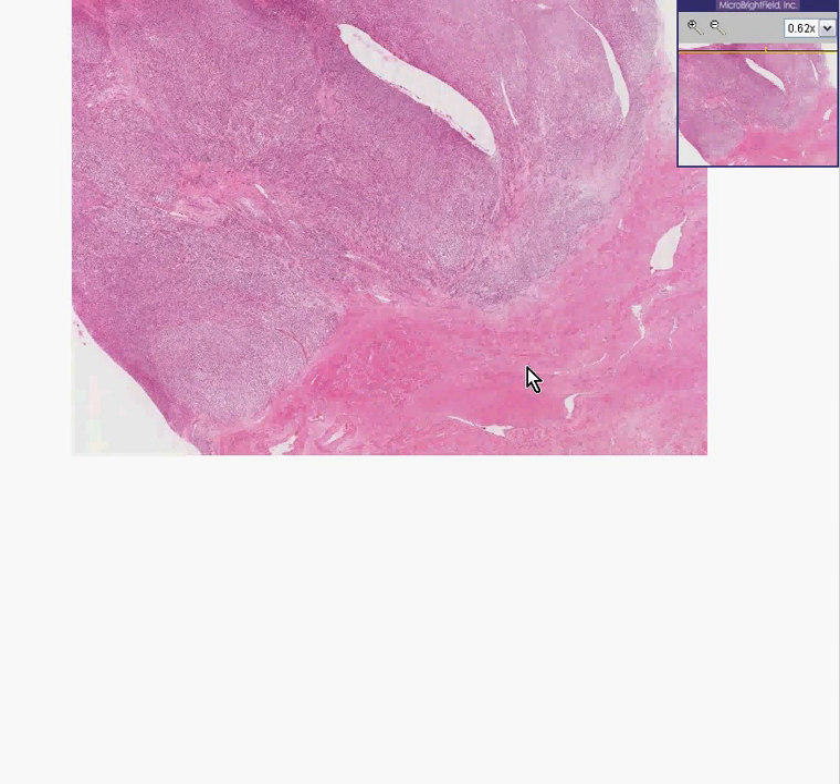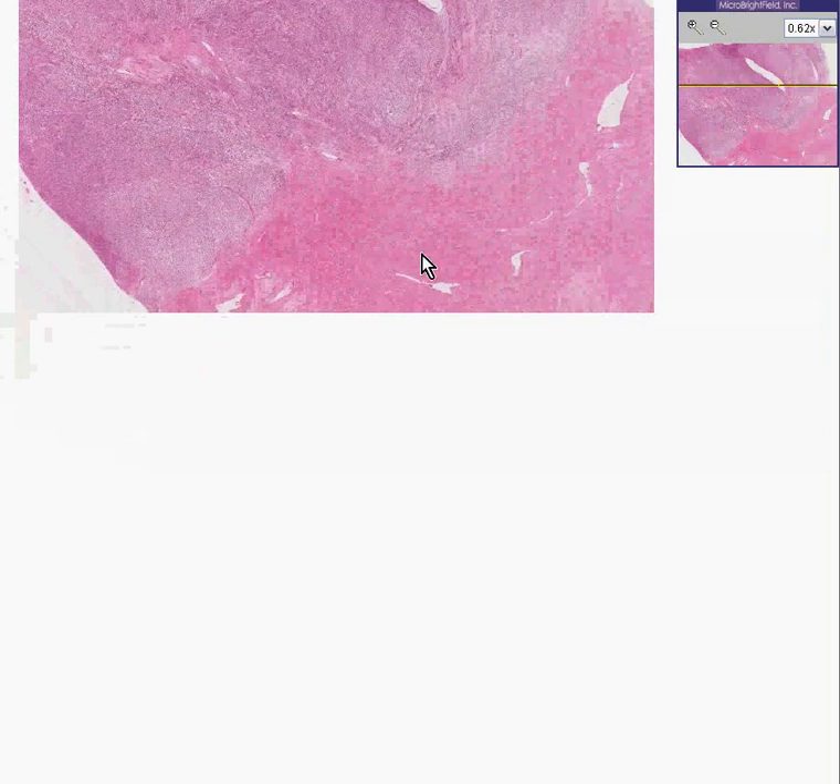Here is another uterus, here is the smooth muscle part, and here is the smooth muscle tumor. Before you say 'another stupid leiomyoma, let's move on to the next case,' let's study it a little more closely.